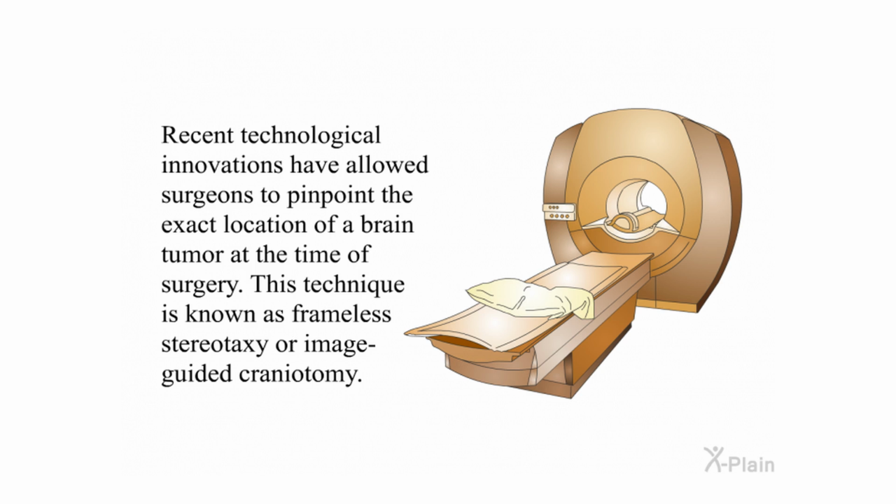Recent technological innovations have allowed surgeons to pinpoint the exact location of a brain tumor at the time of surgery. This technique is known as frameless stereotaxy or image-guided craniotomy.